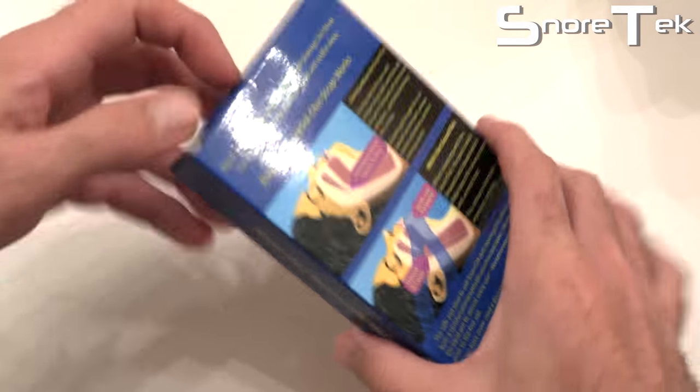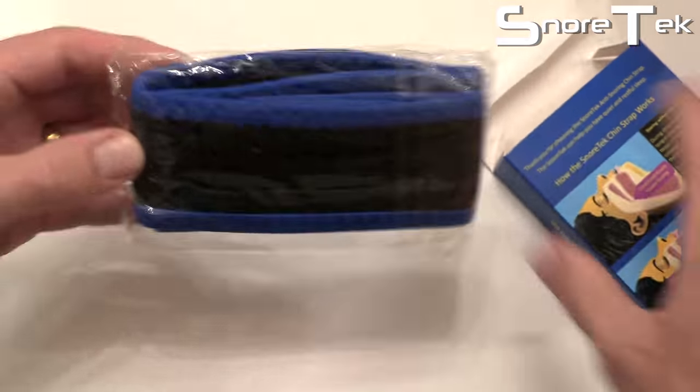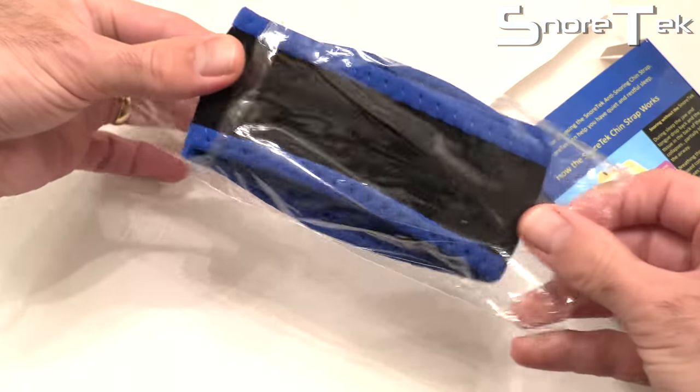The Snortec Chin Strap is designed to stop your snoring while you sleep, by keeping your jaw from dropping back. The Chin Strap comes in this box, which contains fitting instructions on how it works. Simply open the package and you are ready to use it.